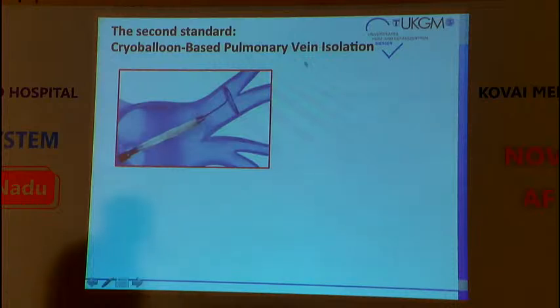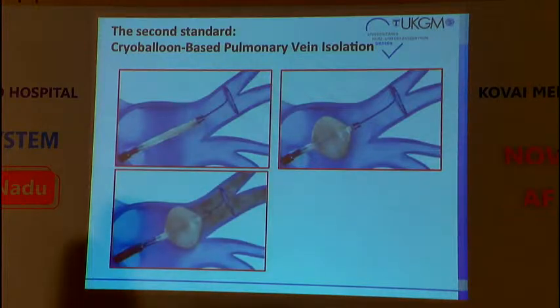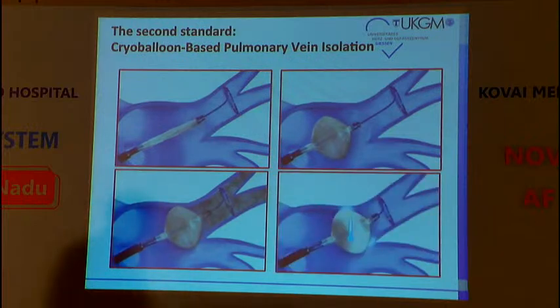So, you target these pulmonary veins with a catheter or spiral catheter. You inflate the balloon, and the next step is very easy. You just push the balloon against the antrum ostium of the pulmonary veins. You give contrast medium, and if the contrast stays there, you know you have a perfect occlusion, and then you are almost done. Just hold it there and start freezing.